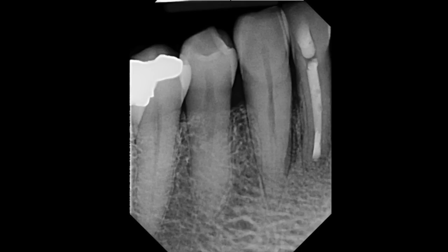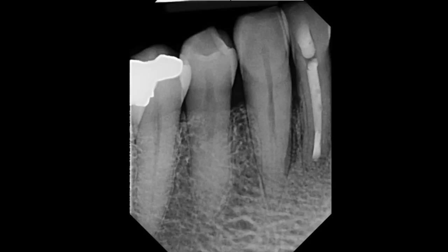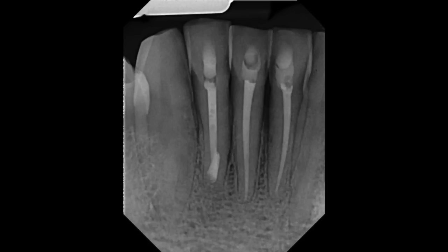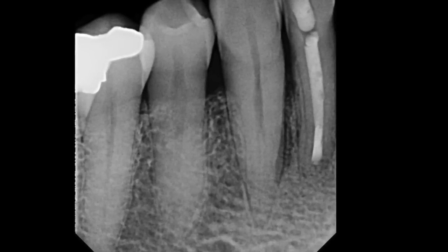Since we talked about mandibular incisors with multiple canals, I also wanted to share a recent case I did involving a mandibular canine with similar root anatomy. Mandibular canines typically have a single canal; however, like incisors but at a lower percentage — about 10% — they may have more than one canal. This patient was diagnosed with a necrotic mandibular right canine. The area had been subject to trauma many years prior, multiple root canals had been performed on the central and canine on the other side, and this lower canine had become necrotic with localized swelling and a sinus tract. An angled radiograph clearly showed two roots, so a CBCT was not deemed necessary.